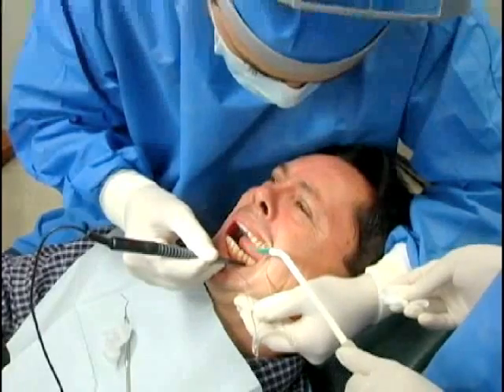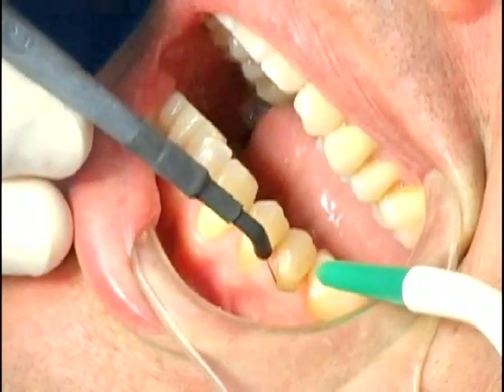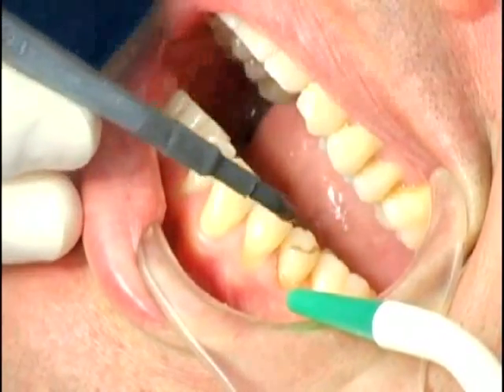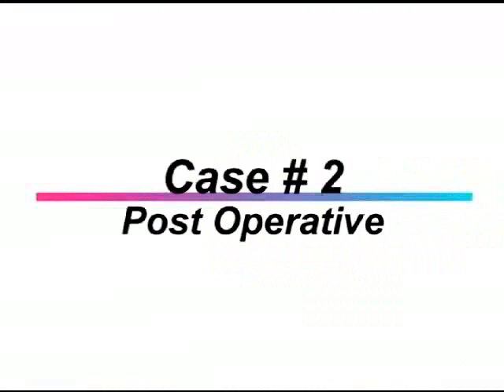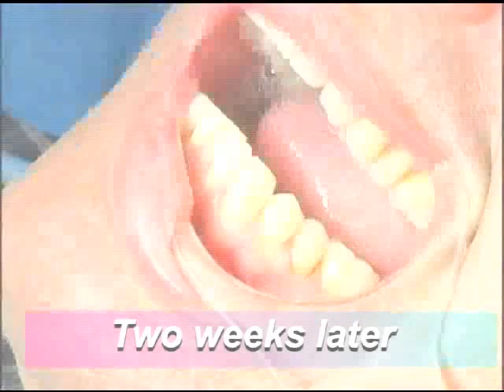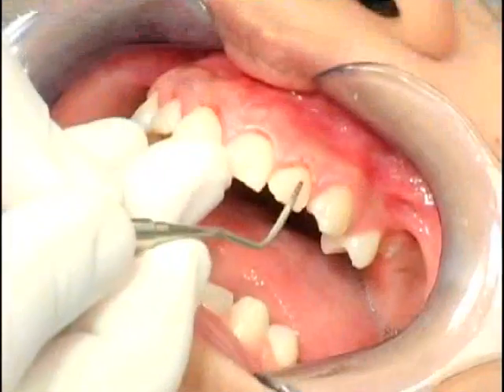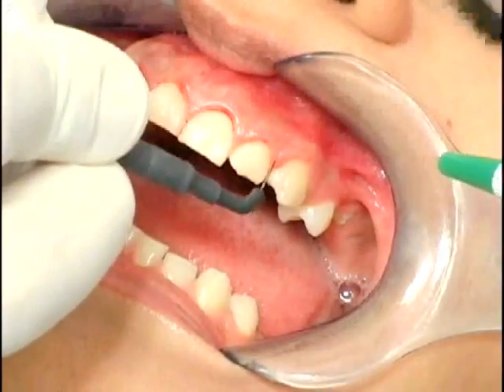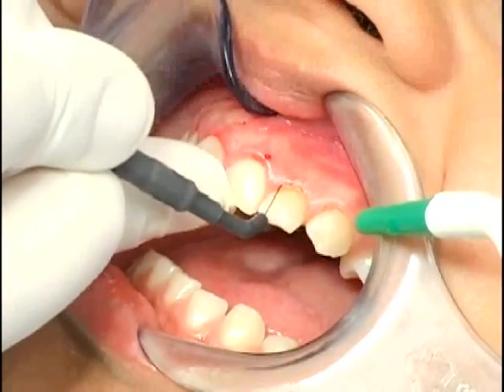Using the long loop electrode, shave the tissue with a smooth, short stroke. Dr. Nicole has taken one pass with the long loop electrode. The electrode neatly and cleanly removes the occluding tissue.